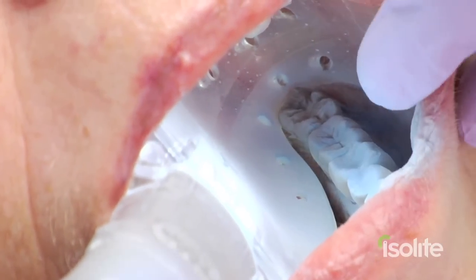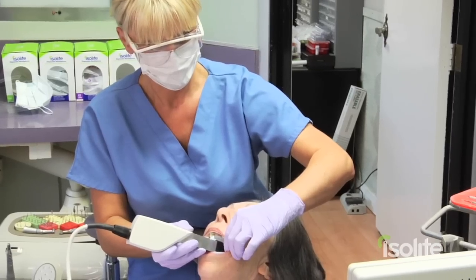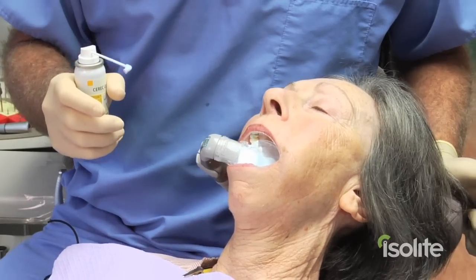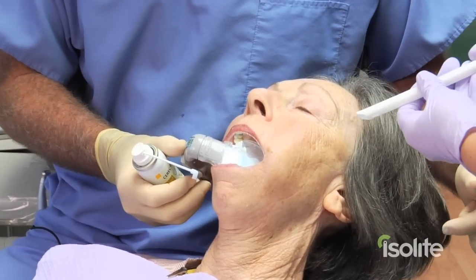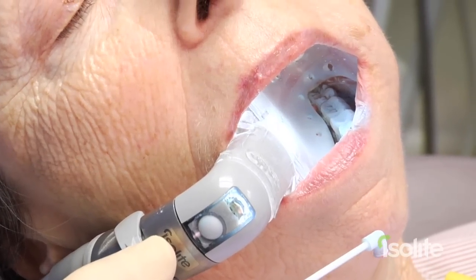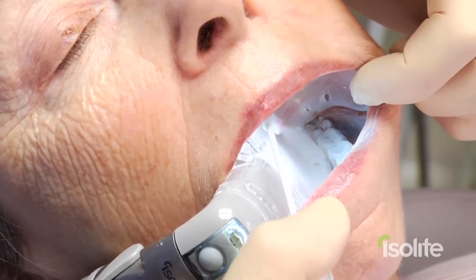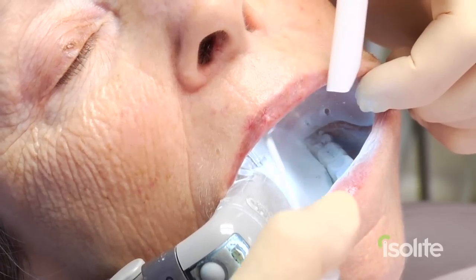As you can see, the isolate keeps that powder well within the mouth. And now we have Rita imaging as she moves things forward. Sometimes when we powder, we notice we get a little excess powder coming outside the mouth, and we can use a secondary HVE — since isolate is used in addition to the HVE — outside the mouth to capture any powder that may come out. Sometimes we do it this way also.